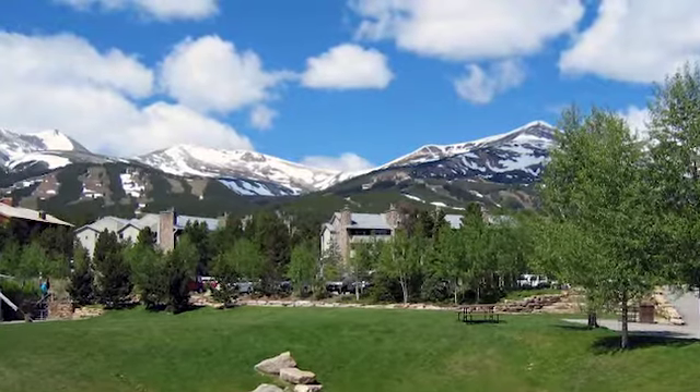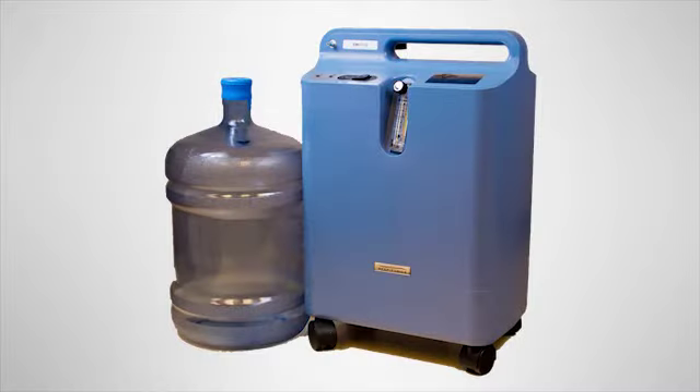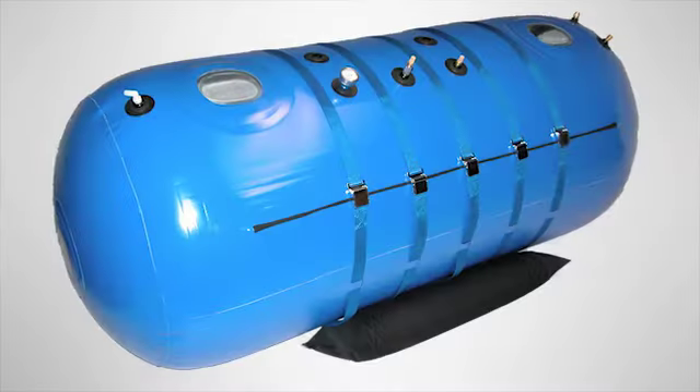The second important factor is your location. Different models are available depending on the elevation of your location. If you live at a higher elevation, like at an altitude of about 9,000 feet, you'll need a concentrator with high back pressure, like the Invacare Perfecto 2. If you live closer to sea level, you need a concentrator with low back pressure, like the Respironics Everflow Q.